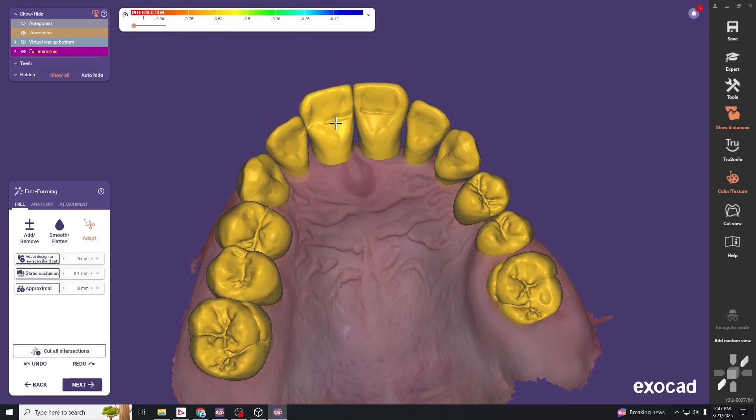Sometimes it leaves small divots, so go back and smooth those out so they look a little better. Quickly remove and smooth once again.